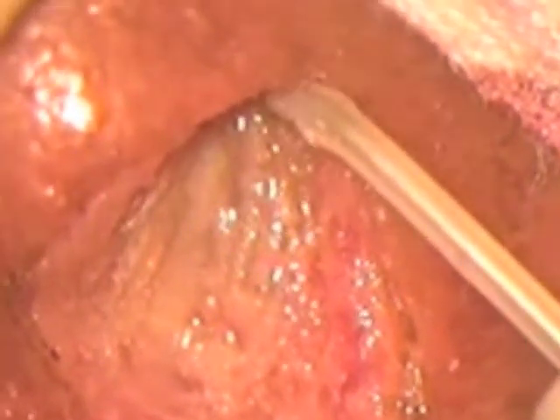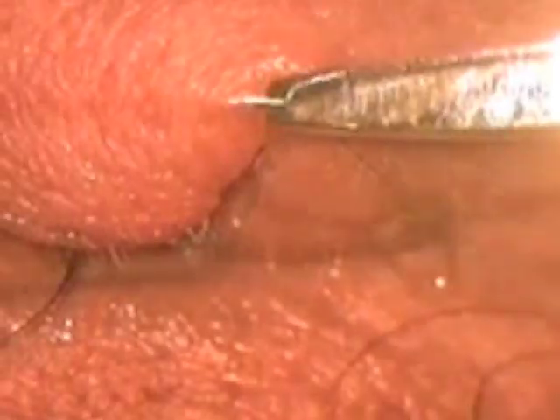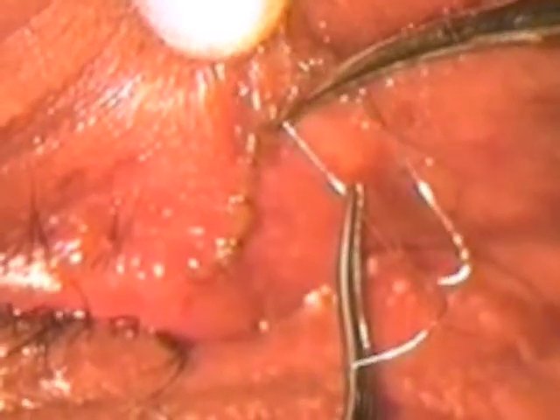The reason these fibers are so thick is that they have been strongly active for a very long time. This is a simple process — keep cutting the circular fibers till the whole depth is cut. Then we apply sutures to the skin. I use stainless steel sutures superficially; they fall off by themselves. It takes only a few minutes to do one lid.